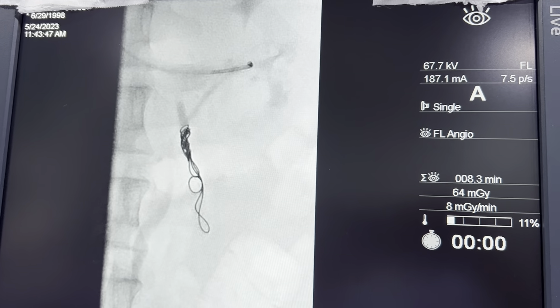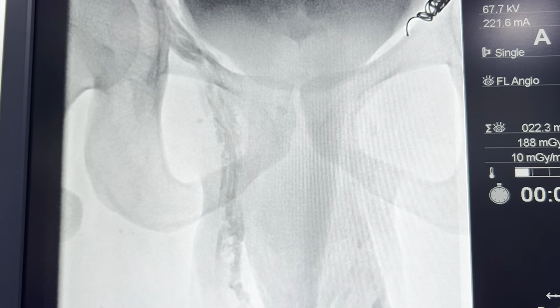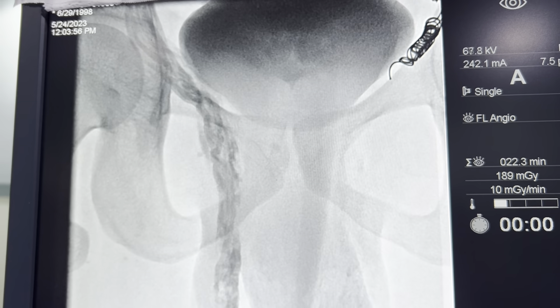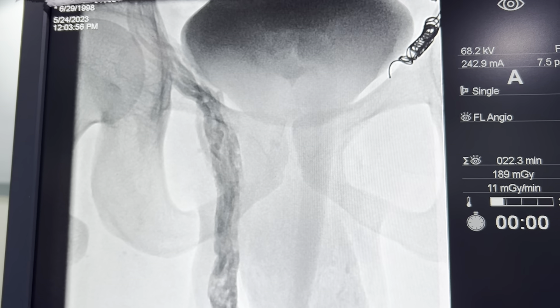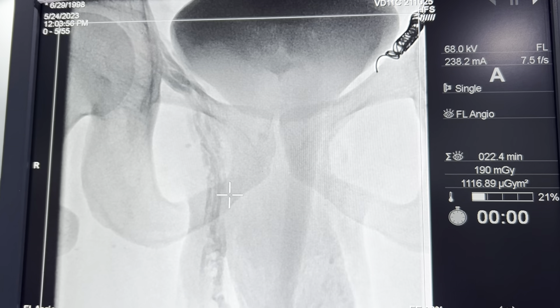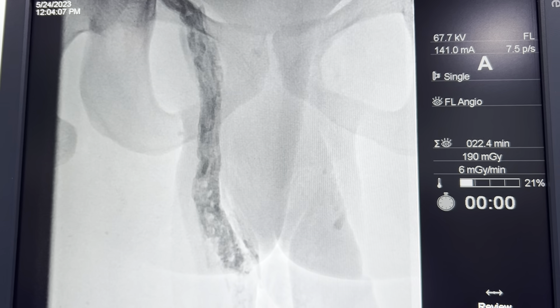You can see there's really no reflux anymore into that vein. You can see the coil from the left side and now we're on the right side. We're injecting on the right side and you see all those big veins coming down again into the scrotum on this side. I'm just going to show you a little lower on the scrotum — you can see the varicocele is there.